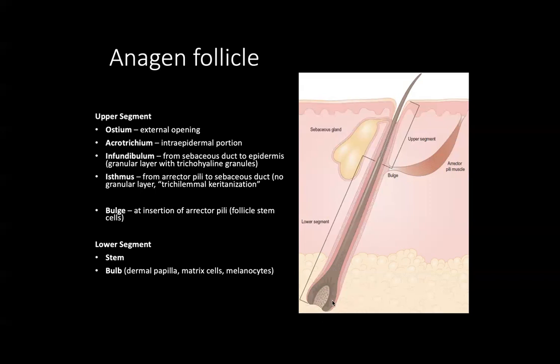In alopecia areata, you have a lot of inflammation around the bulb of the hair follicle here, and that causes a transition from anagen up to catagen and then telogen hair follicles. And so you have this anagen to catagen shift, but you don't actually lose the bulge of the hair follicle, and it's not a scarring alopecia. So eventually the hair can recover and grow back.